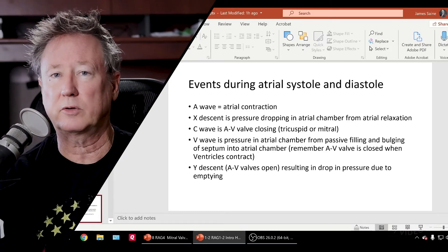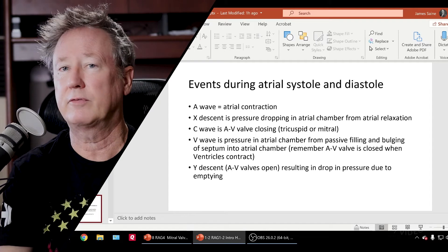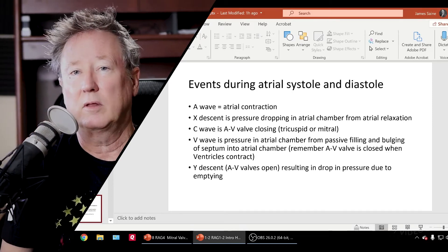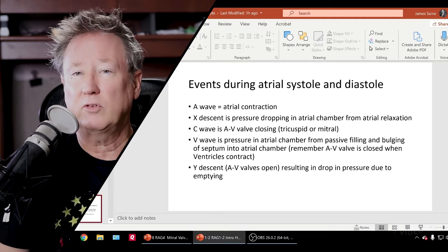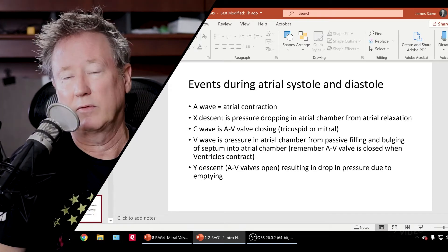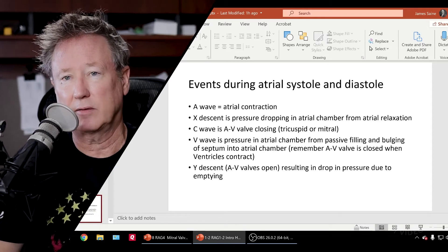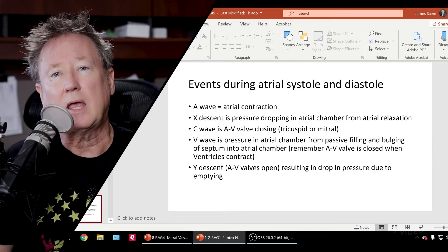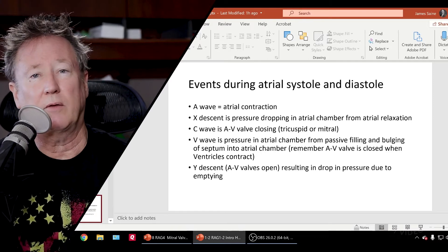In the ventricles, they contract in response to an electrical stimulus — the pressure starts building, the valves open, and the ventricles empty out their contents. The atria are different: there is no valve between the superior and inferior vena cava and the right atrium, and on the left side there is no valve between the pulmonary veins and the left atrium. Starting with the A wave on this waveform: the A wave is the atria contracting — the pressure increases as the atrium contracts. As blood starts emptying, the X1 descent starts dropping. When the pressure in the atria drops below the pressure in the ventricles, the atrial ventricular valves close — the mitral and the tricuspid valve — and if you do see it, that represents the C wave.